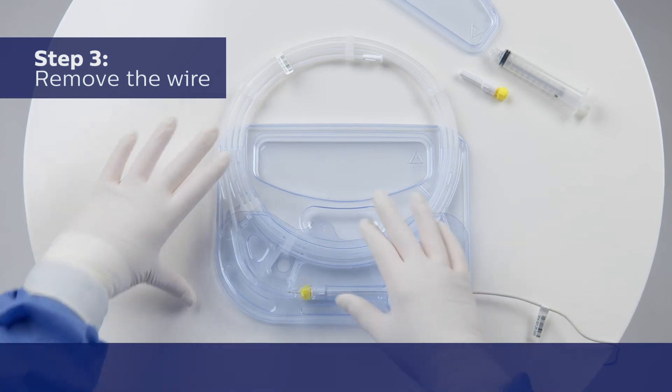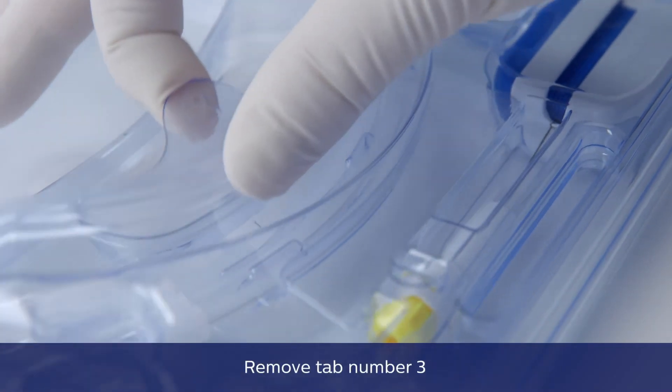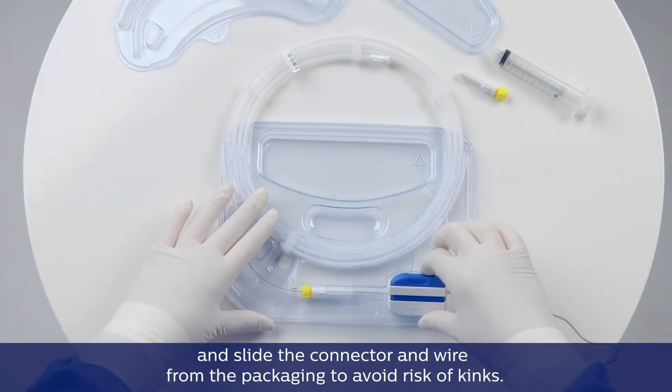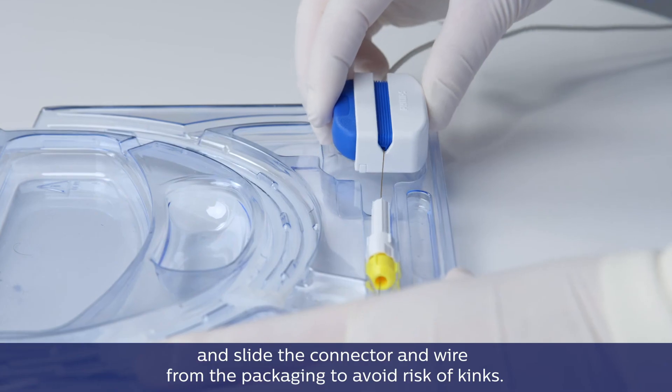Step 3: Remove the wire. Remove tab number 3 and slide the connector and wire from the packaging. To avoid risk of kinks.